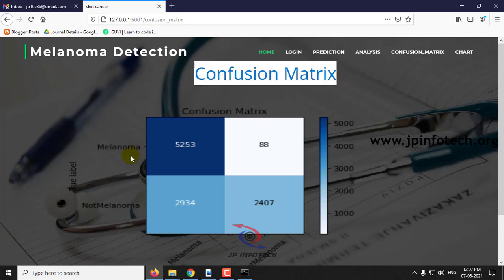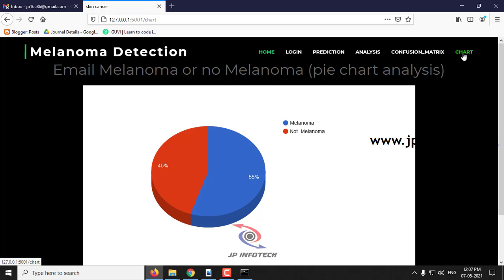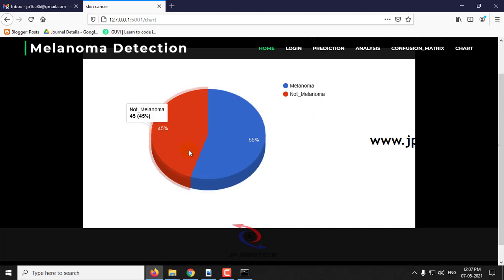So the confusion matrix — you can see the confusion matrix here. Click chart. This is a pie chart analysis; it is not a dynamic one, it is static, based on the dataset images. Not melanoma is 45% and melanoma is 55%.